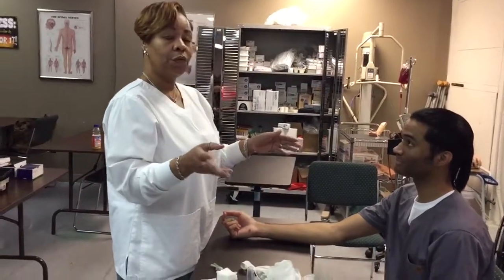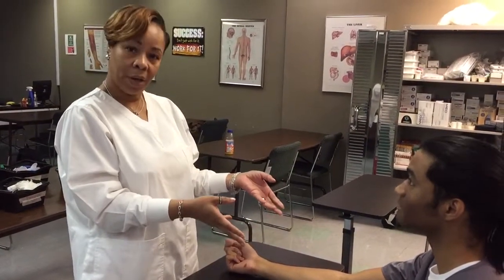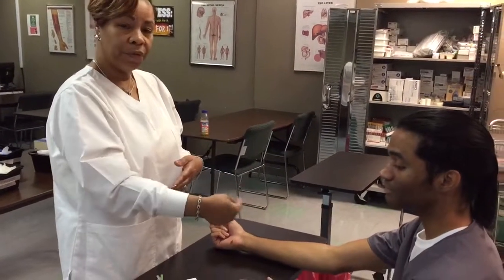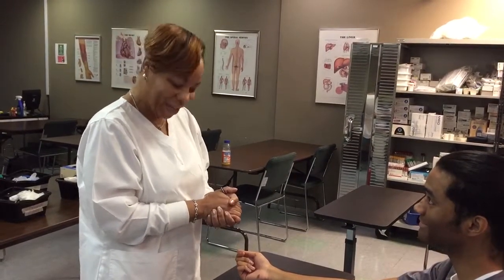The first thing you should do is identify yourself. 'Hi Mr. Stubbs, my name is Kim Lewis, I'm your phlebotomist today, I need to draw blood.' Once the patient puts his hands out, that's a form of consent. Make sure you have the correct patient — ask him to repeat his first and last name and date of birth. 'Can you tell me your first and last name and date of birth please?' — 'Cole Stubbs, 02/11/1991.' Thank you.